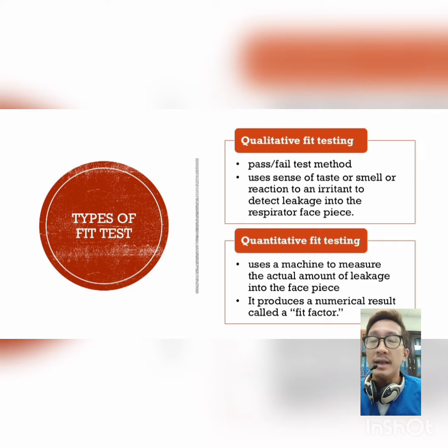When we talk about qualitative fit testing, it is a pass or fail test method that uses sense of taste or smell or reaction to an irritant to detect leakage into the respirator face piece. In our hospital, this is what we are using. The solution that we are using is a bitter solution. If the healthcare worker who undergoes fit testing tastes this bitter solution while donning his or her N95 mask, he or she failed the fit test.